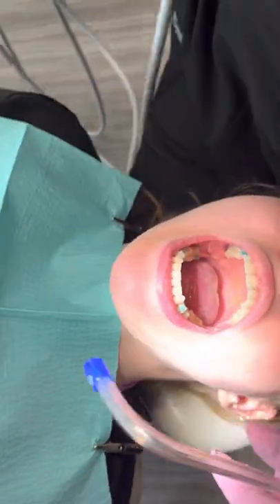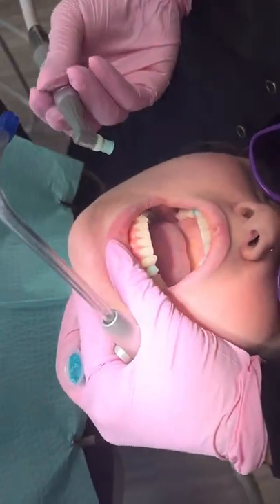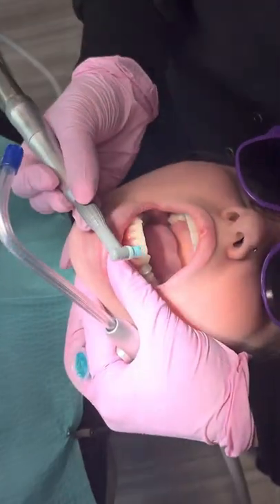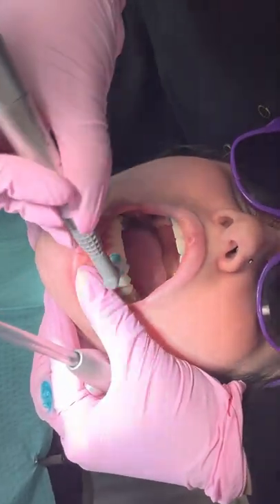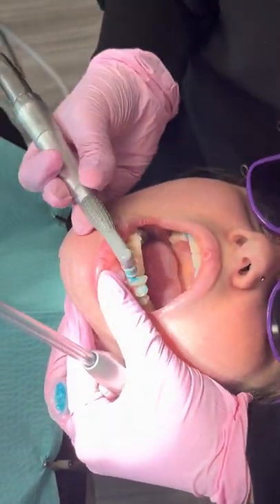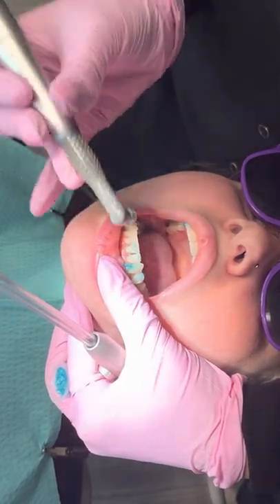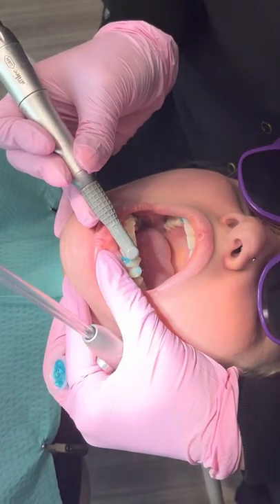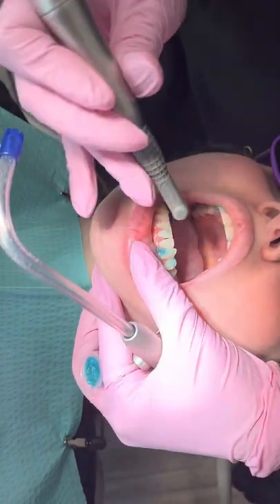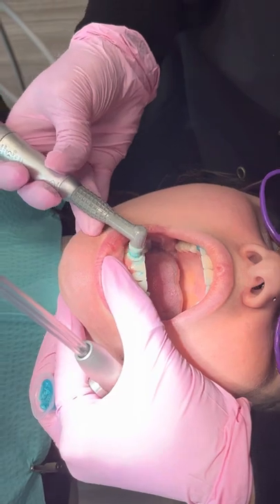Now for the anterior teeth, we're going to retract the lip with our fingers. I'm going to take this and angle it in between each of those contacts — from one side, then the other side. If we just take our prophy and push straight like this, you won't get the whole tooth. Utilizing this angled approach is a great way to ensure that you're getting in between each of the contacts.